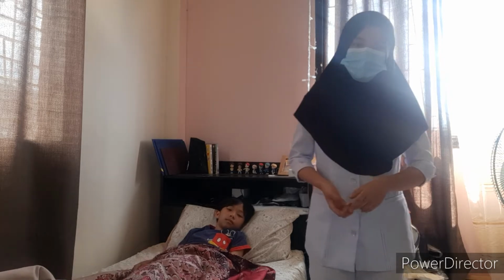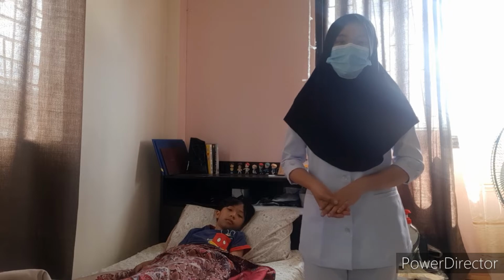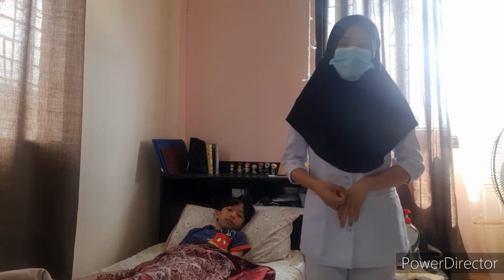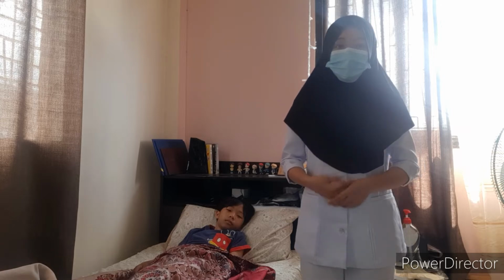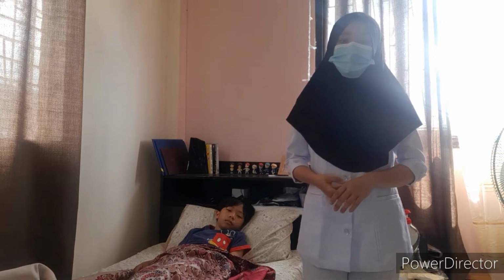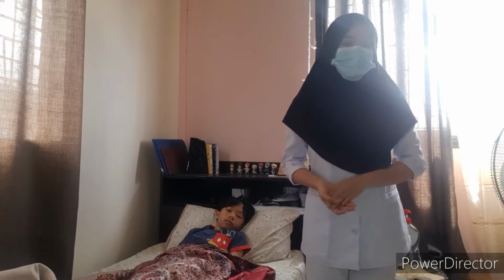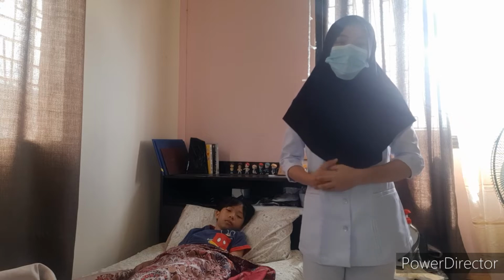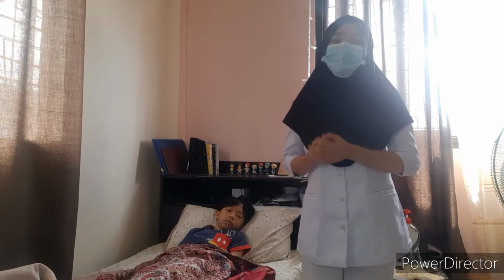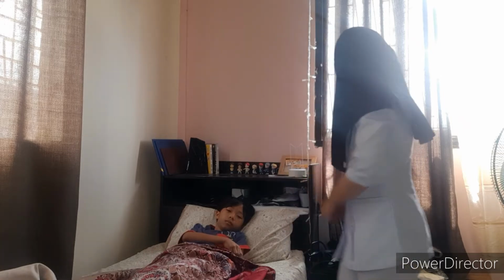Okay. So the next one is we have to gather the necessary equipment, which is the electronic thermometer or digital thermometer with the disposable protective sheathing, two pairs of non-sterile gloves, and alcohol wipes or cotton balls with alcohol, and tissues, and bring to the bedside. So this is to promote the efficiency of the healthcare provider.